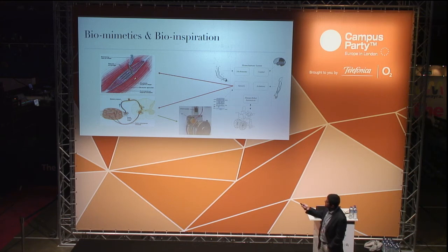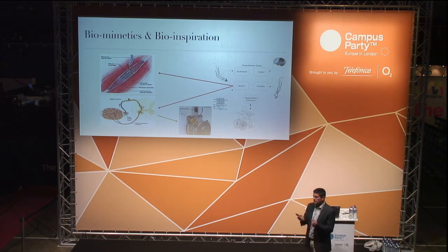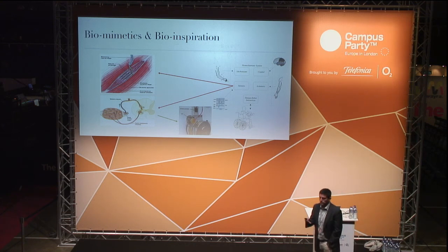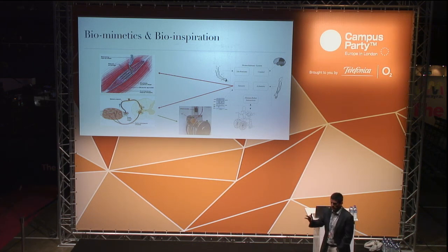And then we have what we call nerve endings integrated in the muscles, which are giving information on elongation, stretch of the muscle, and velocity of elongation. So these are the sensors that we are using, because these are enough to be able to control the system. So we integrated strain gauges in the structure of the exoskeleton, and we integrated potentiometer and Hall sensors at the level of the actuators in order to be able to control the system.